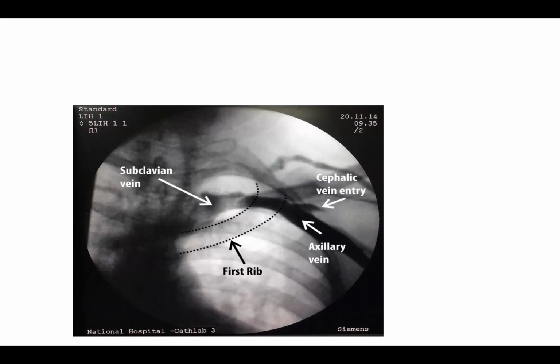If you take a puncture or an access before you create a pocket, once you take the access, you look at the curvature of how the guide wire traverses, crosses from the left to the right through the brachiocephalic vein. All these things help you because after you create the access, you look at it on fluoro again to see where your guide wires are. So that helps you and gives you more confidence that you are in the vein.